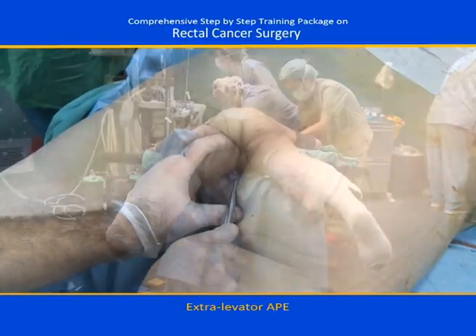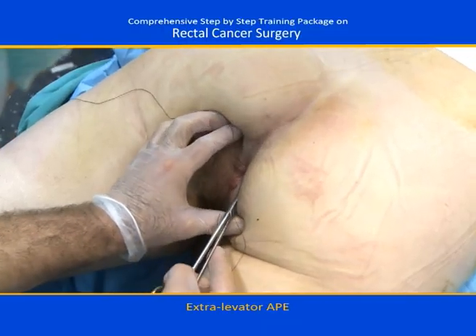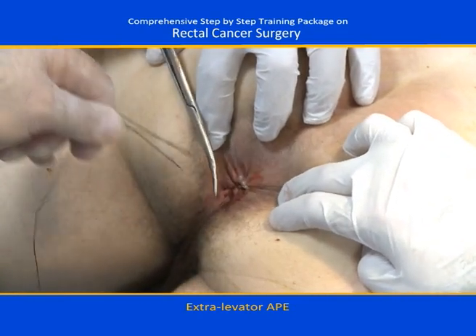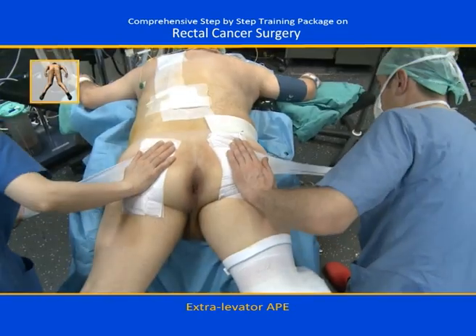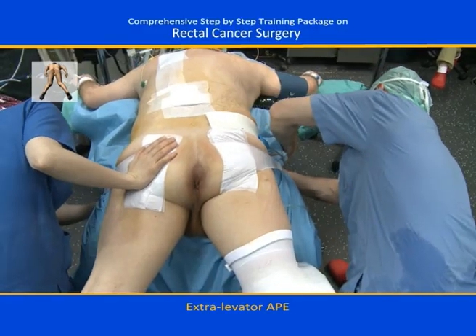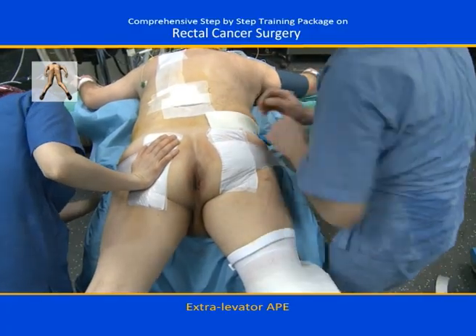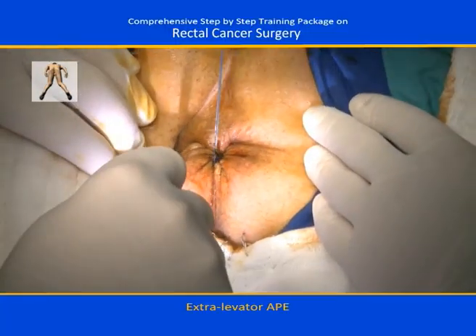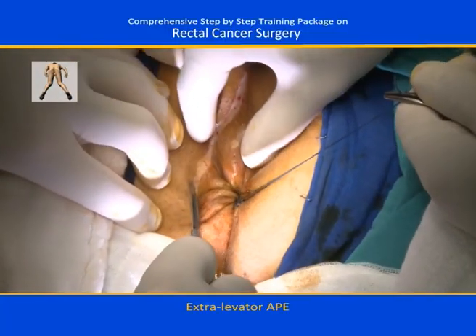The legs of the patient are separated and the purse string suture is placed around the anus before starting the sterile covering. For better surgical access in the perineum, the buttocks are separated. Then, a second purse string is applied. This will prevent contamination of the surgical wound.